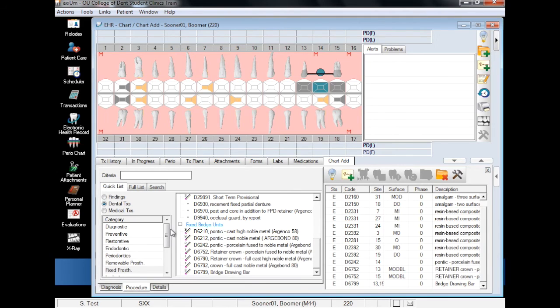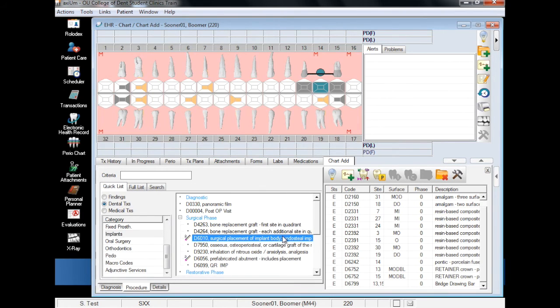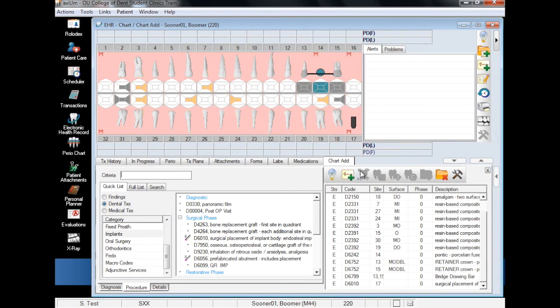Finally, we will add an implant by selecting Implants from the Category menu, select the appropriate finding, choose the space where the implant is found, and finally, add finding.